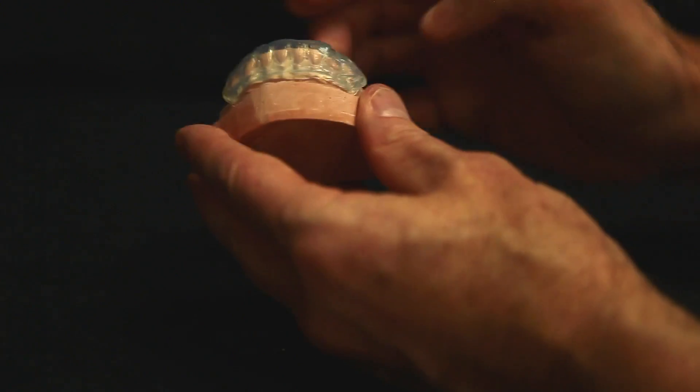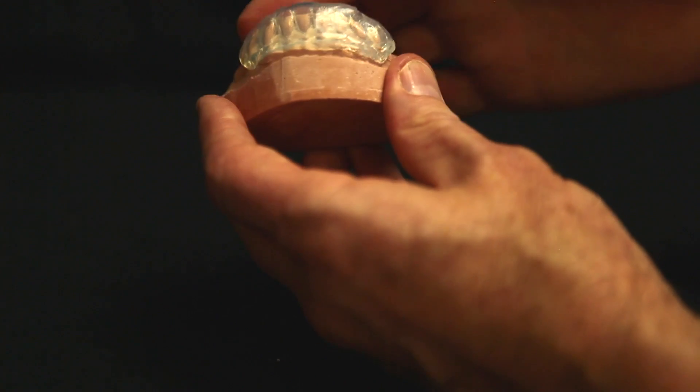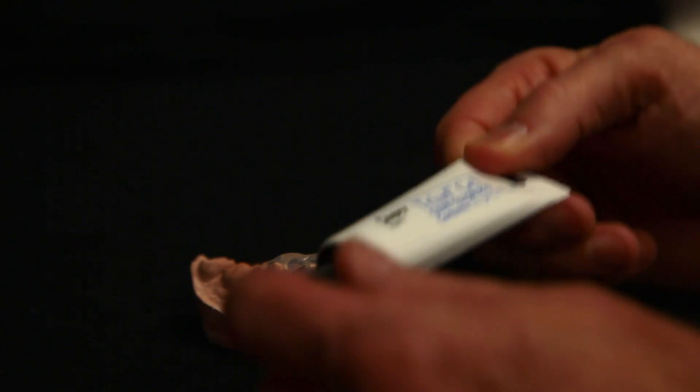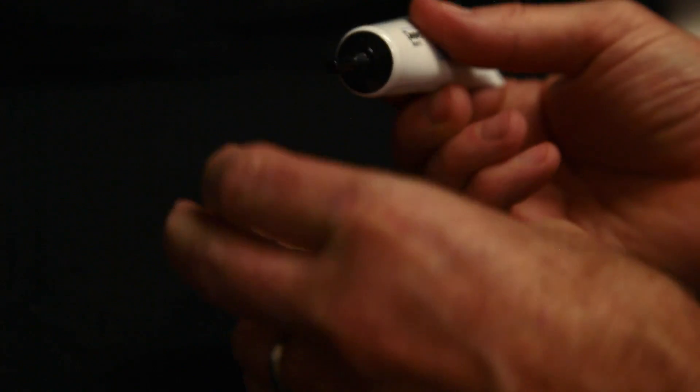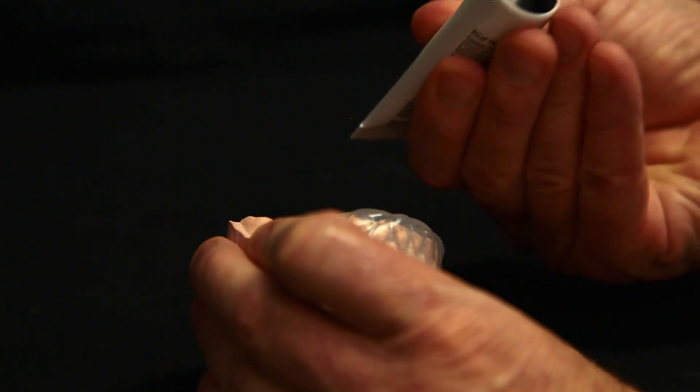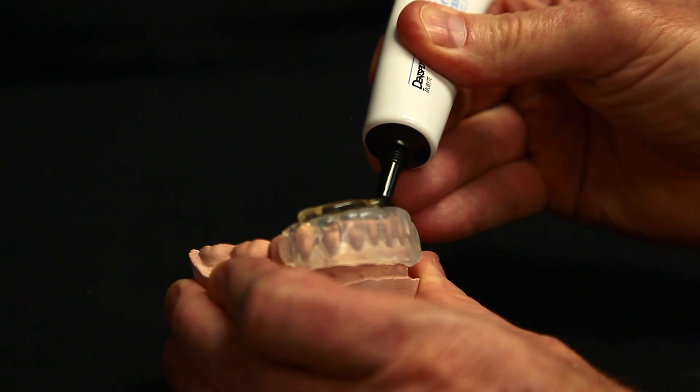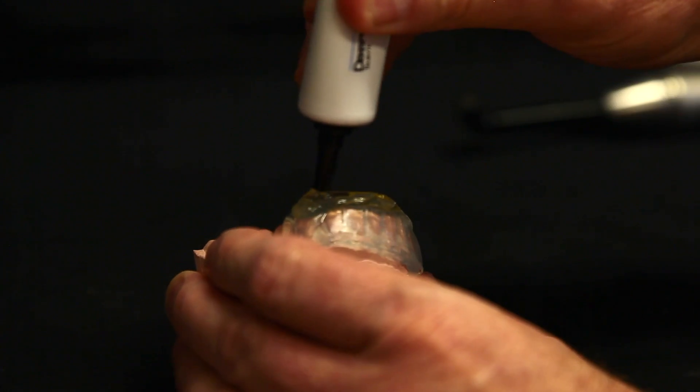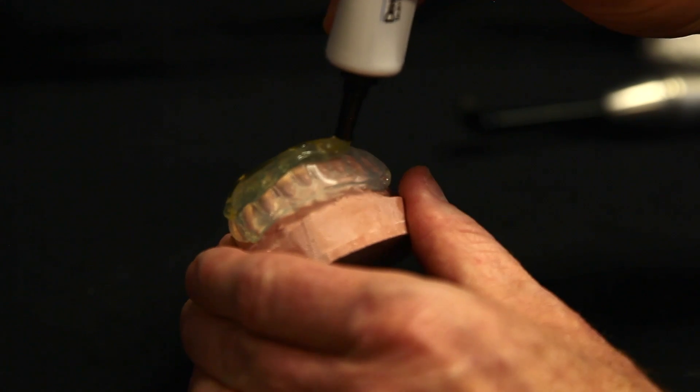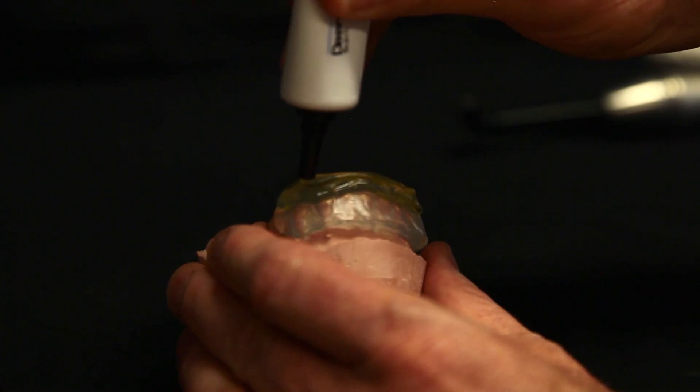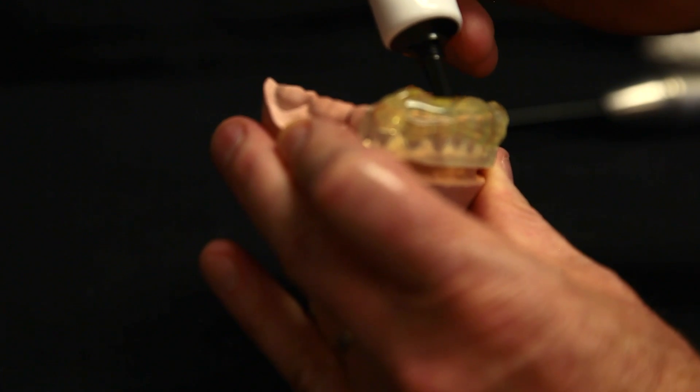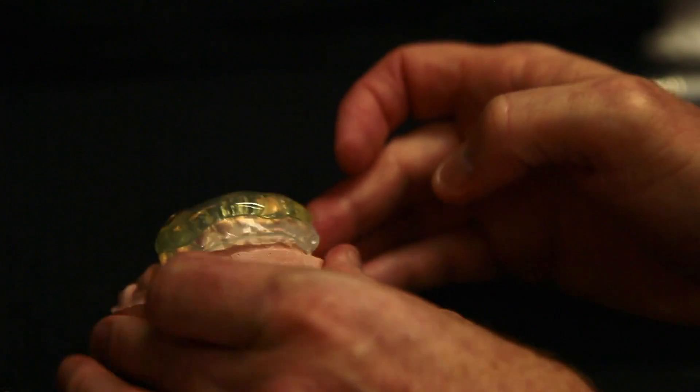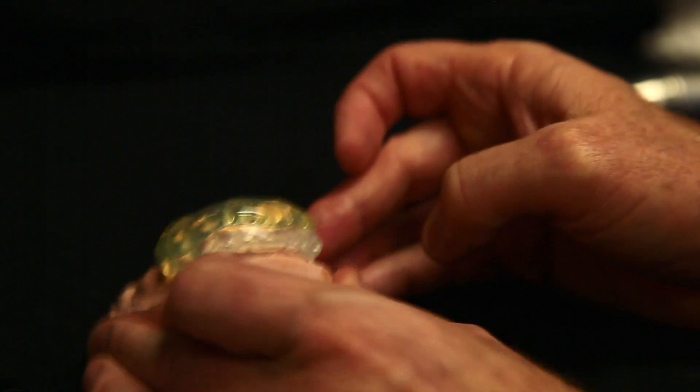So what we do is we're going to go ahead and now fabricate a hard shell matrix over the top of this. We're going to be using Triad Gel, Clear Colorless by Dentsply. And what you do is we're just going to flow a thin layer over it. And this is kind of like thick honey, this material. So you get it here. And then you can just lightly tap it or if you happen to have a lab vibrator, you can go ahead and do that.